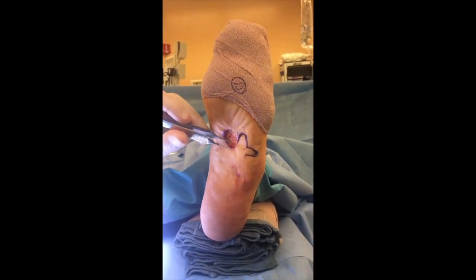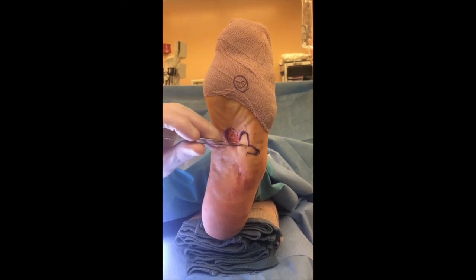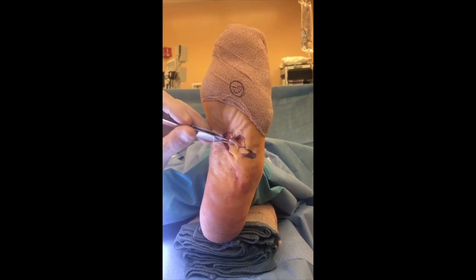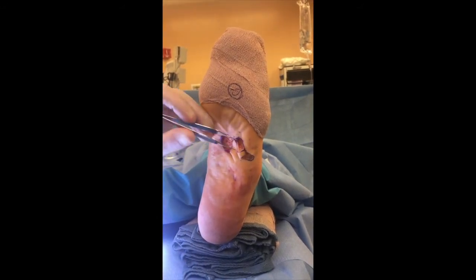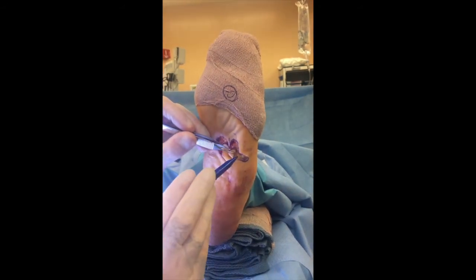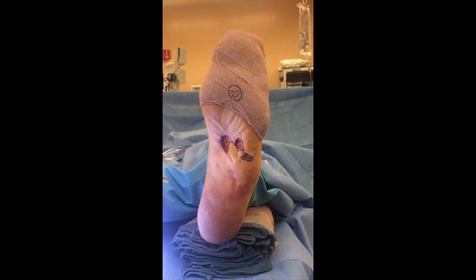The flap has been developed. The way this rotates is: the first thing you close is this apex to this apex — here to here — so we'll rotate that over and that closes first. Then second will be this apex to this apex, and then you can close everything else in a Christmas tree fashion.